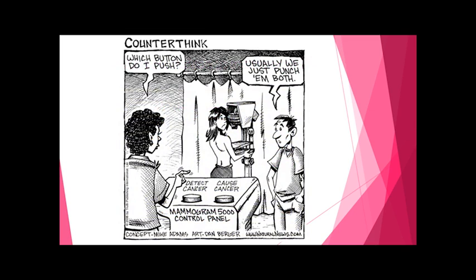I like this little cartoon. I think it's cute, about which button do I push. And they said, well, usually we just punch both. One button says detect cancer and the other causes cancer. And patients tell us technologists all the time, you're giving me cancer by doing your mammogram.